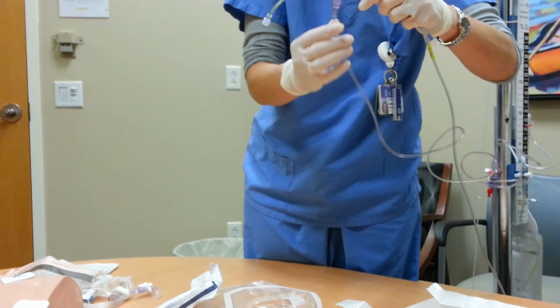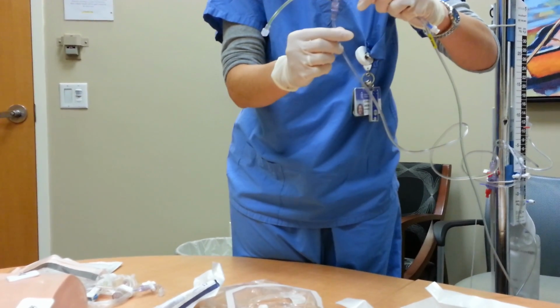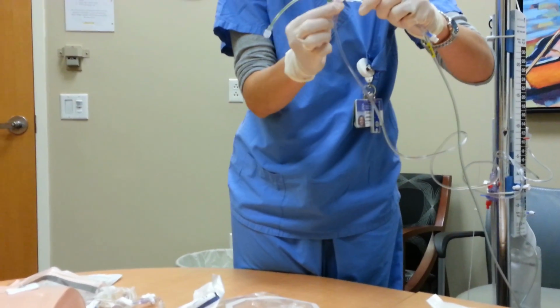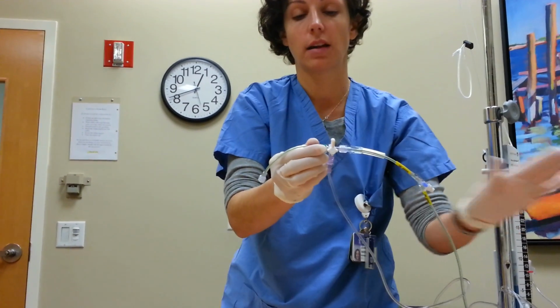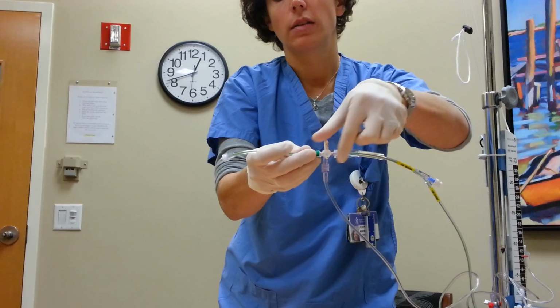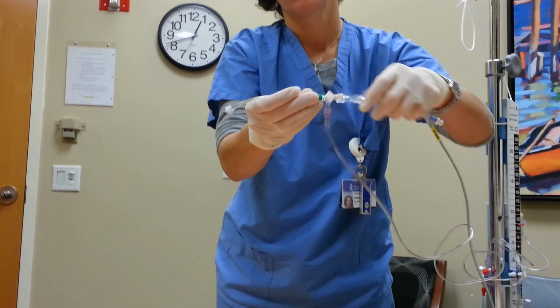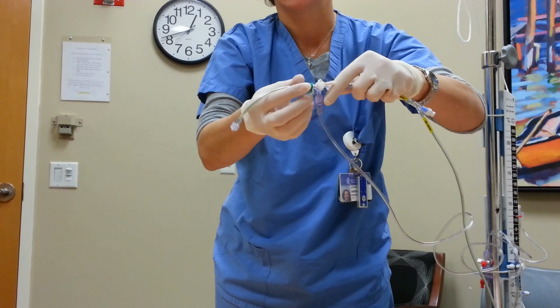The only problem is that while you have it open 3 ways, this pressure will not be entirely accurate because this transducer is transducing a pressure on this side for the patient, and it's also being impacted by the pressure on this side of the system. So in order to get a truly accurate ICP, what you want to do is turn the stopcock off to drainage so that the transducer is communicating with the brain and the patient side only.